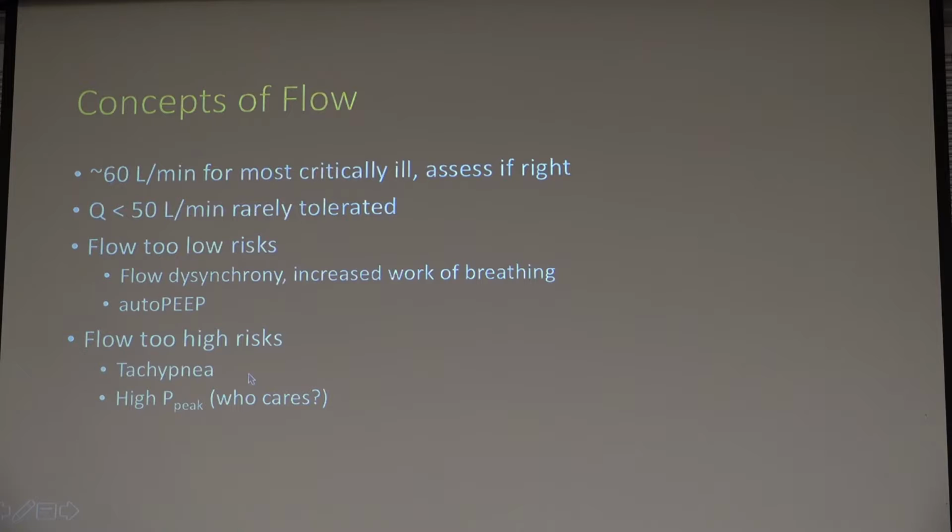Also, increased flow is going to increase your peak pressure, but as we know, increased flow is not going to change your plateau pressure, because by definition, plateau pressure is in the absence of flow. So who cares if your peak pressure goes up just by increasing your flow? So try to ignore that value, even though the alarm will start going off, but change your alarm, not the ventilator.